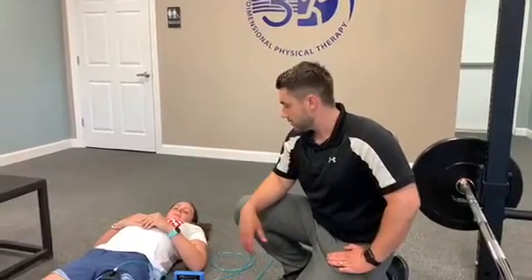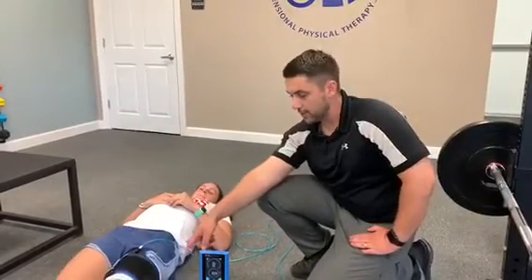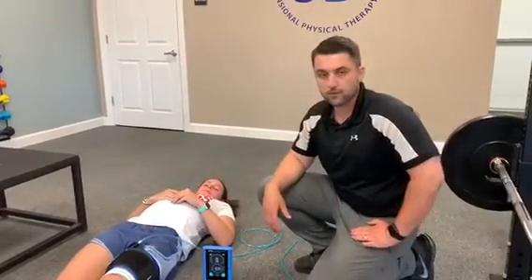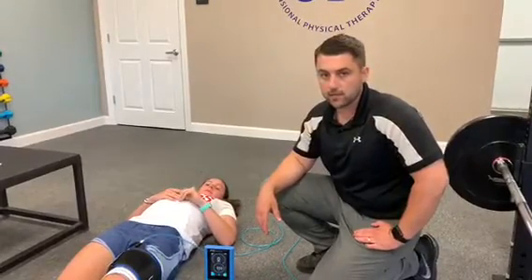Hey guys, it's Ryan from 3 Dimensional Physical Therapy here with my friend Sydney Wolfston, who has had surgery on her knee. She had an MPFL reconstruction about four years ago and is still dealing with some quad weakness on the left side.